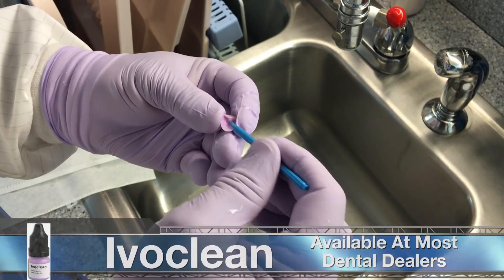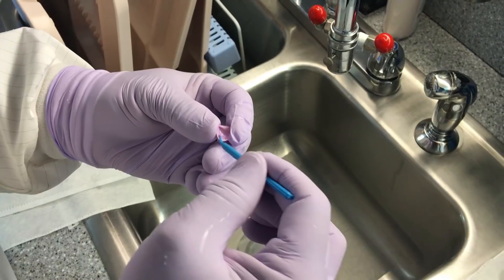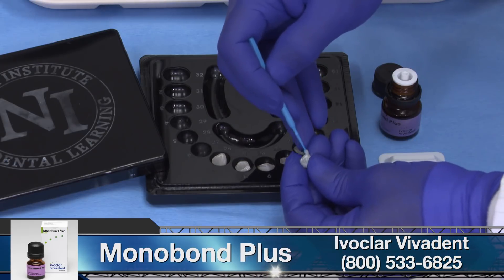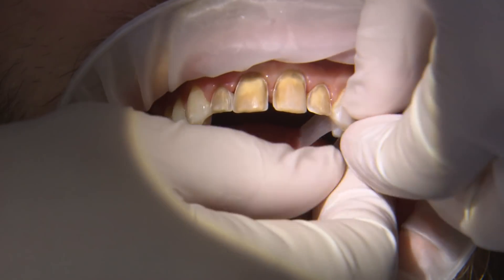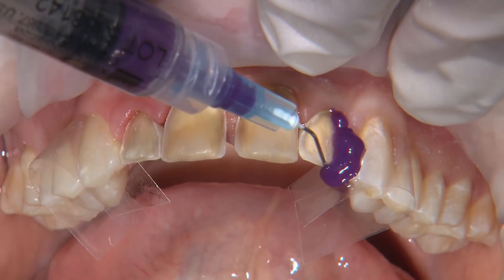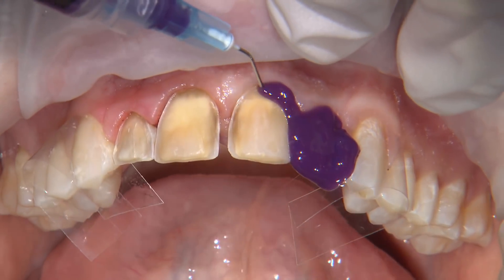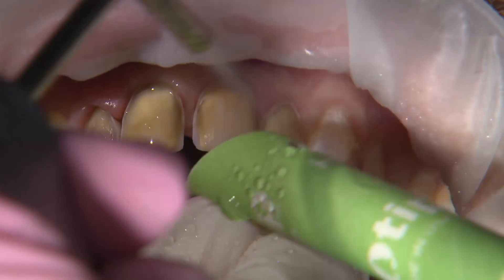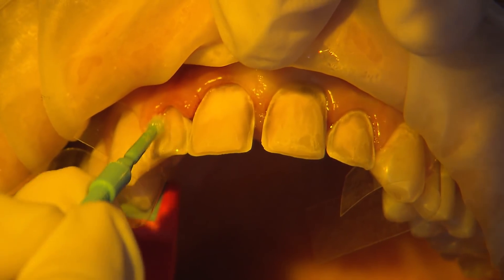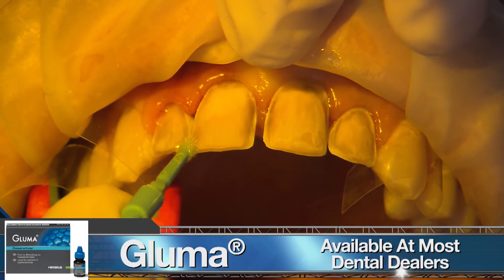To prepare the veneers for cementation, we apply IvoClean to the internal surfaces for 20 seconds, then rinse and dry. Afterwards, we apply a coat of Monobond Plus, which contains the required silane coupling agent to allow the resin cement to adhere to the ceramic surface. For the preps, I use a total etch technique to maximize the bond. I first protect the canines with a clear mylar strip, then apply 37% phosphoric acid on all of the preps for about 20 seconds. Next, I apply a thin layer of Gluma desensitizing agent to all of the preps and allow that to sit for at least a minute, then aspirate any excess.